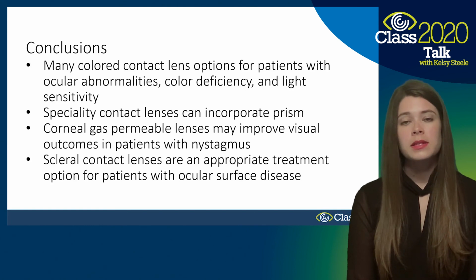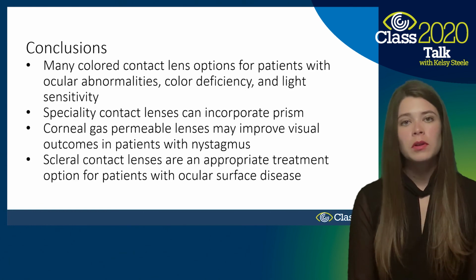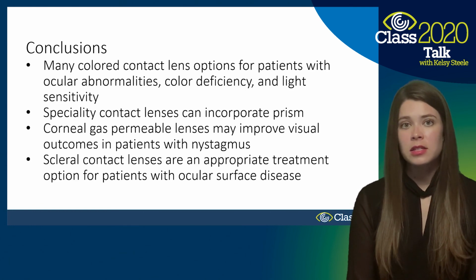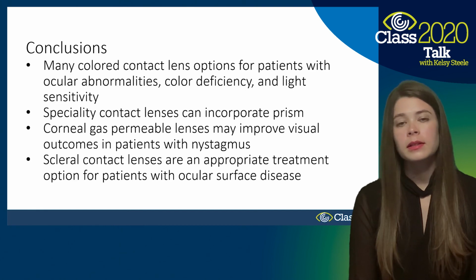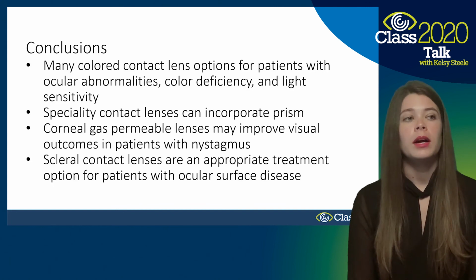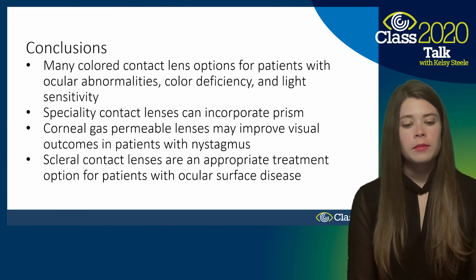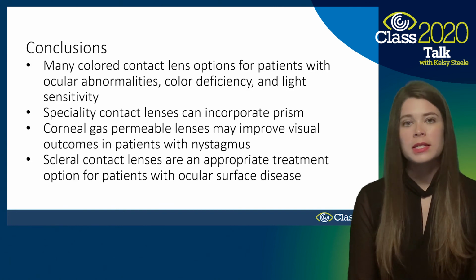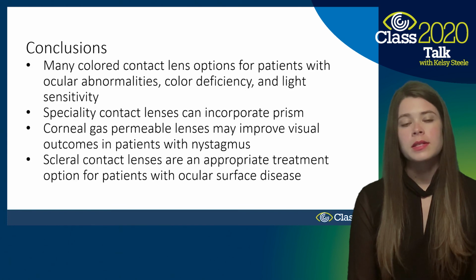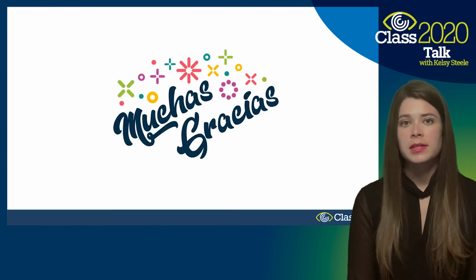I really hope that you give this a try and that you have this as an option for your patients, because it can be very rewarding and make your patients so thrilled, improve their quality of life and their confidence. If this is something you're interested in getting started with, I would reach out to some of the specialty labs that you work with to see what kind of options they have, what kind of specialization and parameter specifications you have, and also what kind of information, what data do they need from you to get started, so that you're setting yourself up for success and you're ready to fit the next patient that walks in your door requesting the service of you.